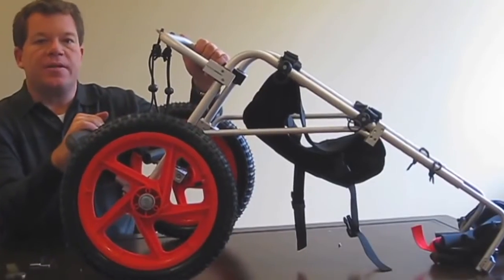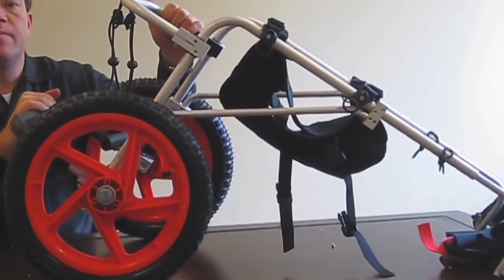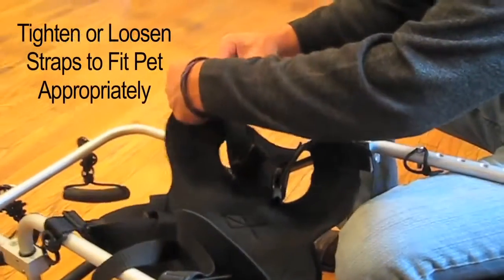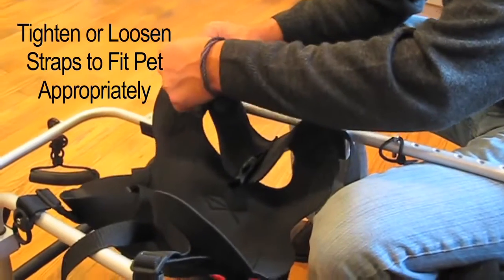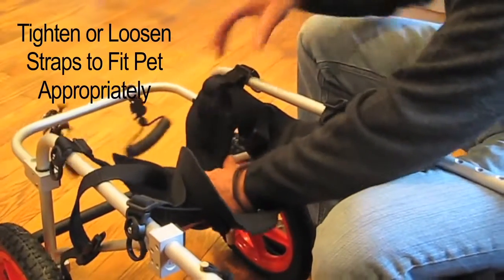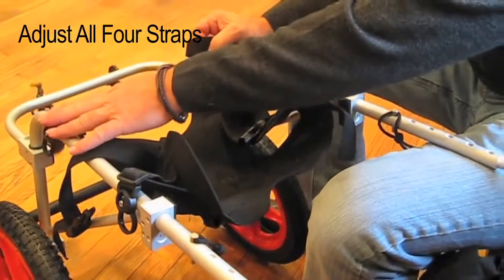Now the Best Friend Mobility large dog wheelchair is assembled and we're ready to fit our pet to it. The dog needs to be up — the harness needs to come up farther. Take up the slack that's in it. In this case for Pepper, we're going to bring it in all the way. I brought it up — see how tight it is here — and then repeat that for the other adjustments.